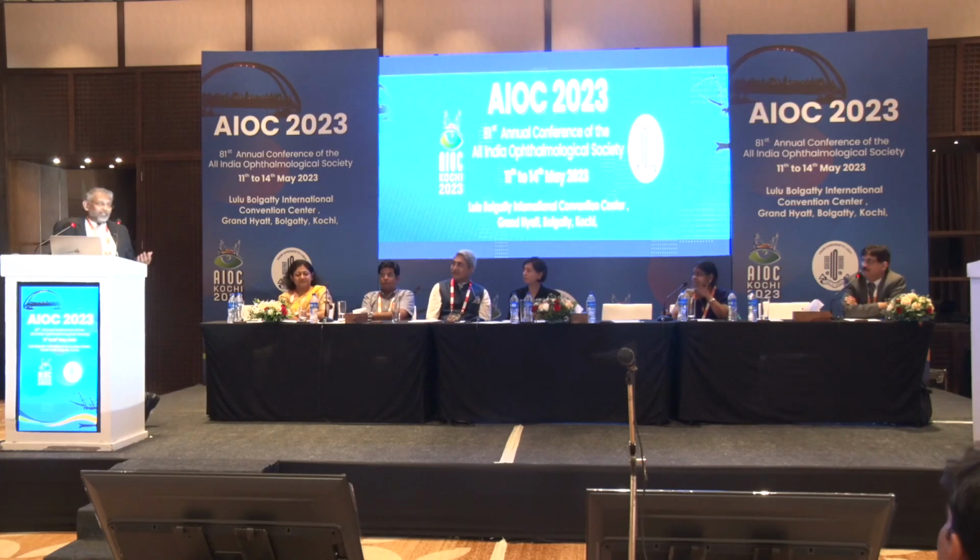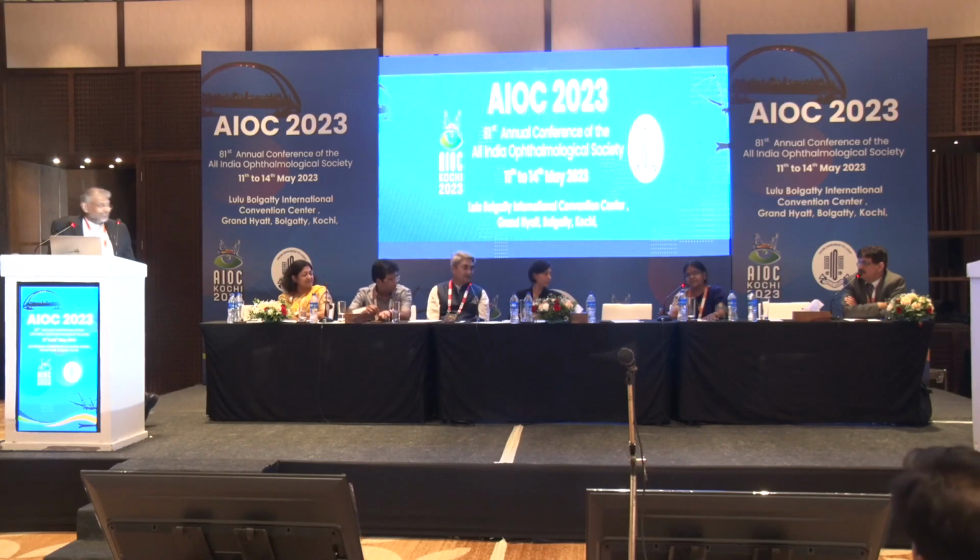But as we said, all these are emergency procedures. People are doing them in the periphery. They may not have an artificial chamber, but the King's clamp is a very economical alternative to have this done in a meticulous way.